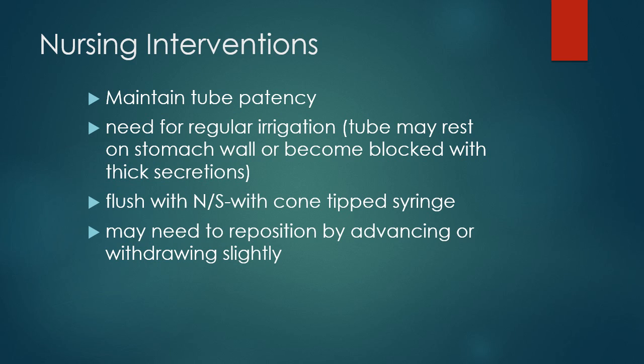Sometimes we just have to reposition the patient. So if the tube is lying on or stuck inside the stomach lining, then just moving the patient onto his side may help reposition that tube inside the stomach.